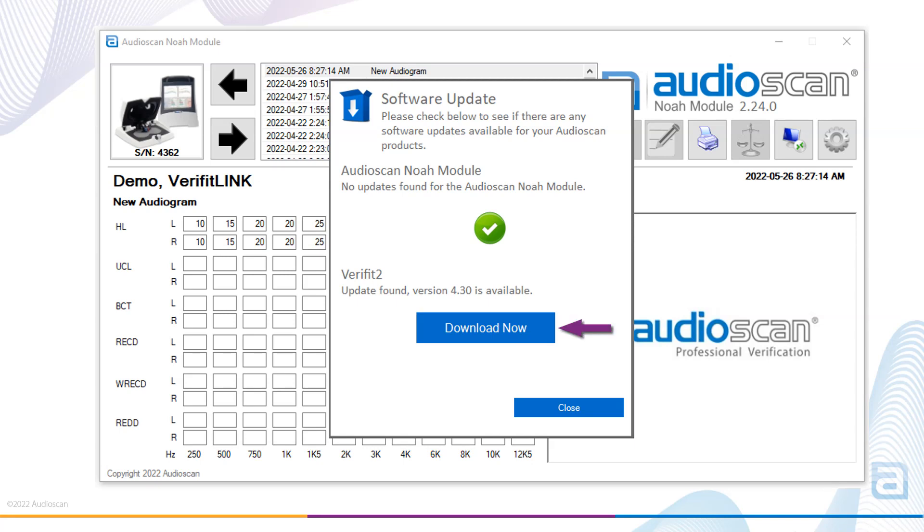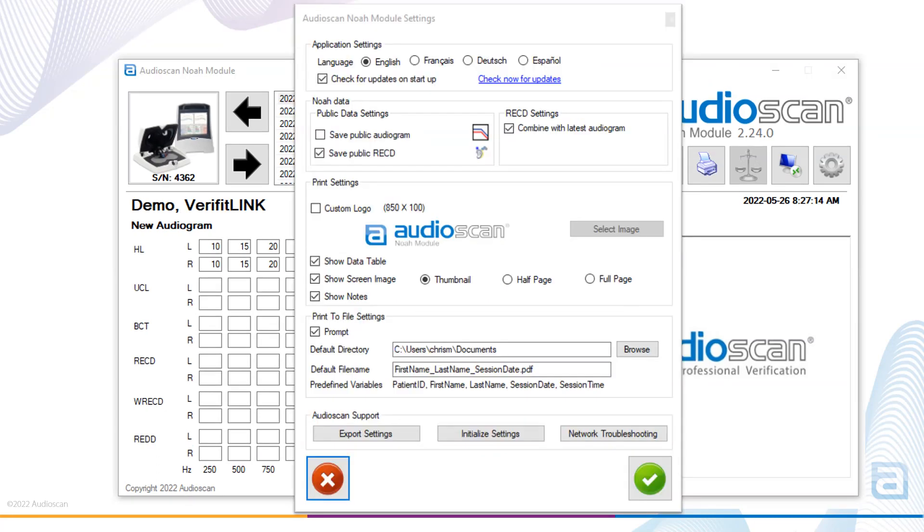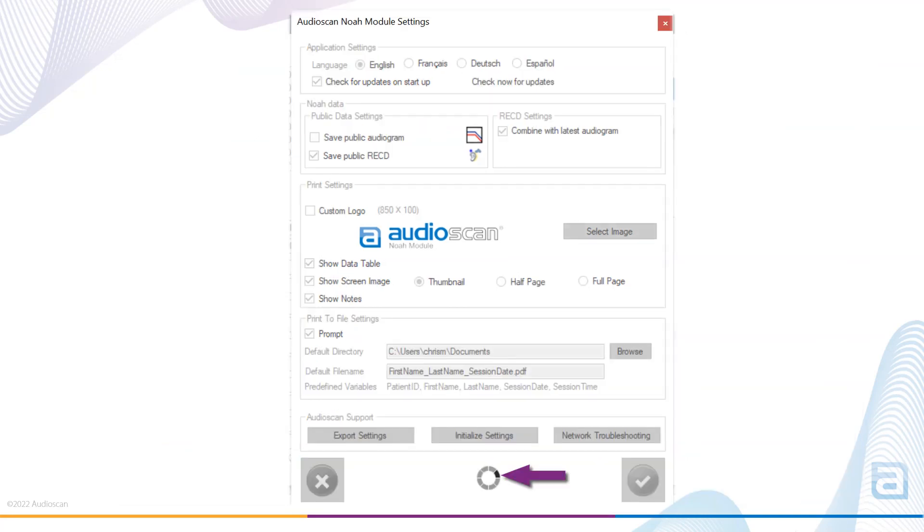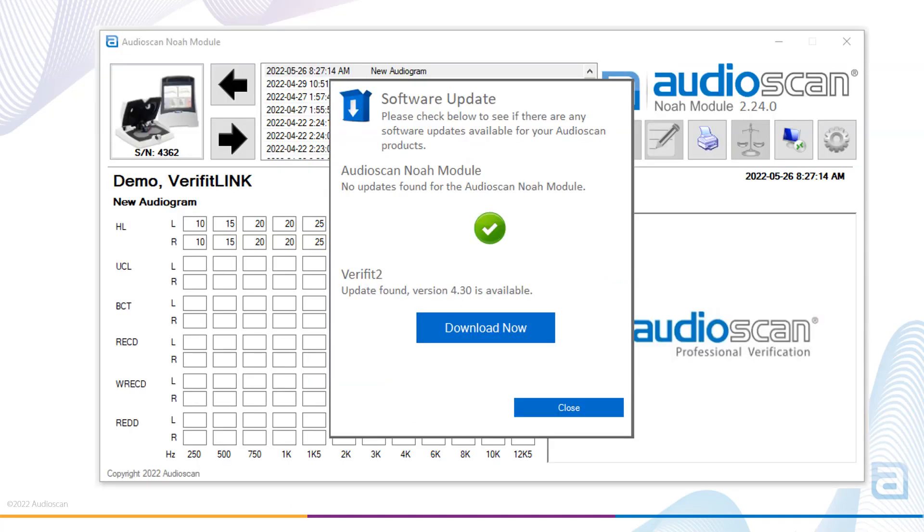If you have not checked check for updates on startup and prefer to manually check for software updates, at any time you can manually check for software by selecting check now for updates. The module will briefly check the software versions of the Audioscan Noah module and your Verifit 2 or Axiom versus the latest available software on the Audioscan website. If the currently installed version is the latest available software, a checkmark is shown along with text that indicates no updates were found.